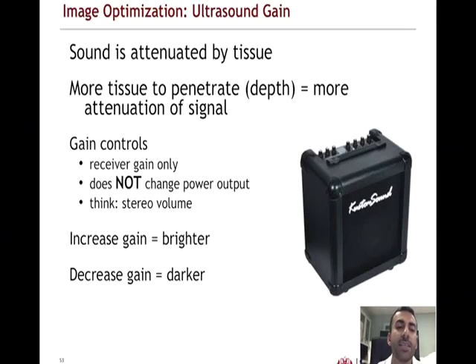All gain does is make everything in the image brighter. It makes no difference in terms of telling the difference between levels of amplitude or degrees of intensity of the ultrasound waves getting reflected back. Rather, it just applies the same degree increase of signal amplitude across the board. So in essence, it makes everything brighter. It's a post-receiver alteration.